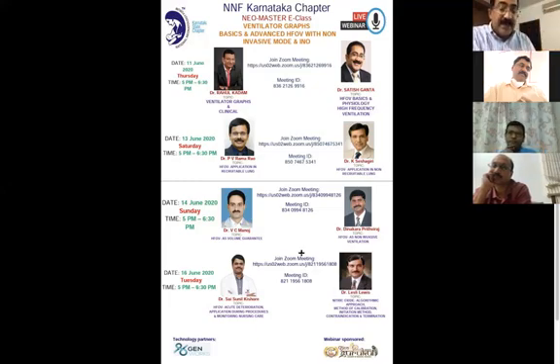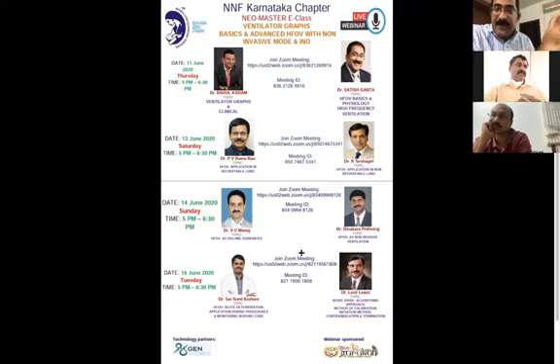And when you get your blood gas at the end of 45 minutes, that is when you see, yes, I'm on the right track. If it's not good, you need to change it, get the next blood gas. And only when it is well recruited and you have an amplitude which is reasonable, and a delta P or a frequency which is reasonable, is the only time you need to step out of the room, not otherwise. I hope I've answered your question.